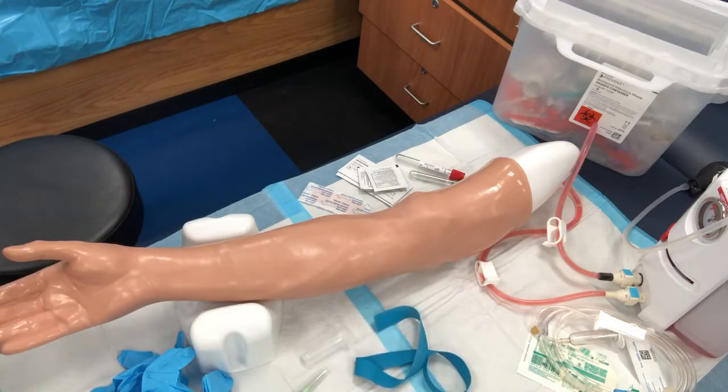So first you're walking in, you're introducing yourself to your patient. I hear that you are here for some laboratory studies today, and your patient will say yes. And one thing I like to ask is if they have a hand preference or if they've had veins on one side or the other be accessed easier. Some patients will say they always are able to hit me on this side or the other. Typically that's the patient who has blood drawn frequently or tends to donate blood very frequently.